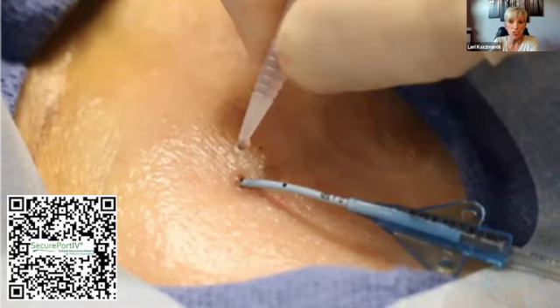I'm a big fan of direct visualization of the site. You can visualize not only the appearance of the site and any evidence of bleeding and oozing, but also if there's migration of the catheter, especially with our PICCs, central lines and such. There's still a lot of discussion about sutures. Sutures are always the challenge, especially on our IJ catheters, because they're put on to stop the catheter from pulling away, but then they're also bleeding and oozing. And sometimes that causes the unscheduled dressing change more than the actual insertion site bleeding and oozing. So you can put a drop of glue over each of those puncture sites on the skin to stop those from bleeding and oozing too. So lots of ways you can customize and use it, but yeah, CHG discs and gels, you can use both with and then again without.